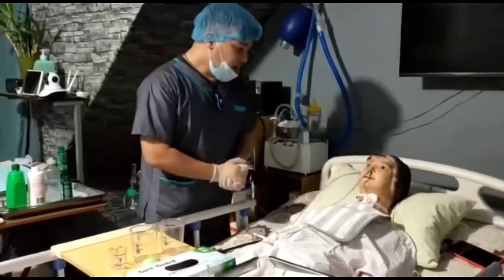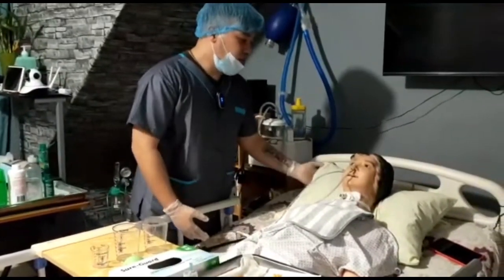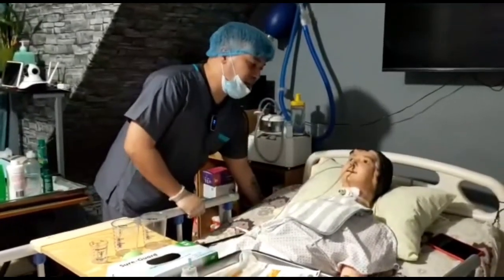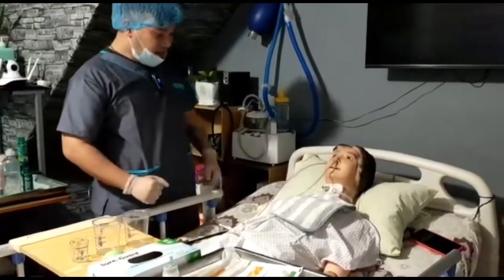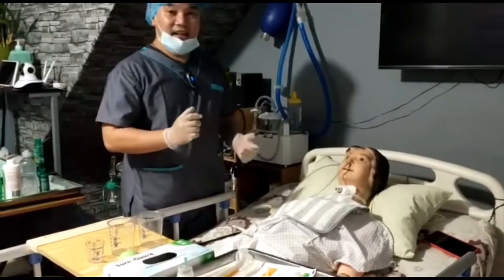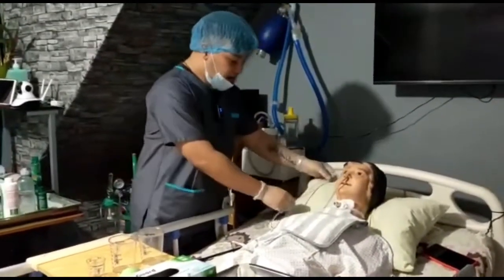Ayan. So, hi ma'am! Papakainin ka na namin ngayon. So, itataas po natin yung bed mo. Yung 45 degrees. Ayan. So, assuming na po na naka semi-Fowler's na tayo. And then, next is i-check natin kung intact ang kanyang NGT. Ayan. So, paano po natin gagawin yan?